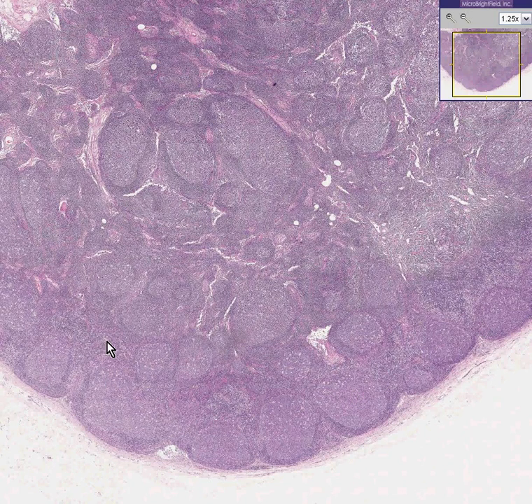In fact, it looks as though they're going all the way into the medulla, and they're competing with these cords and sinuses here. This is an overabundance of follicles, which are larger and more numerous than they should be, but the overall architecture is preserved, and there's no evidence for tumor of any kind. This is a benign hyperplasia, or what they call a reactive lymph node, or a hyperplastic lymph node. And because it's chiefly due to follicles, this is follicular hyperplasia of a lymph node.